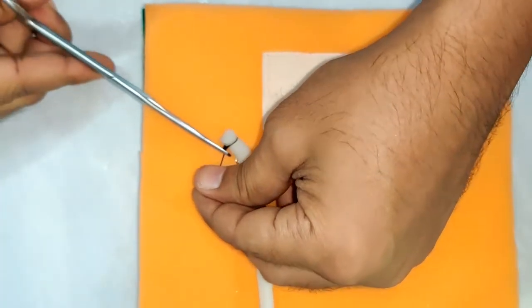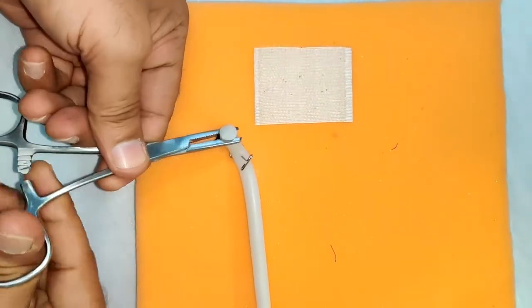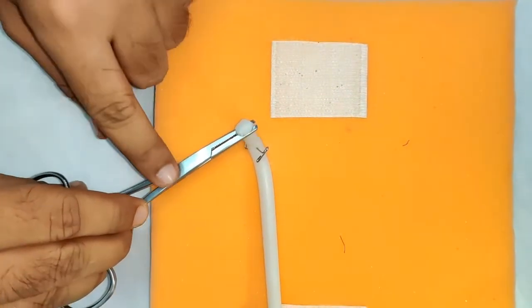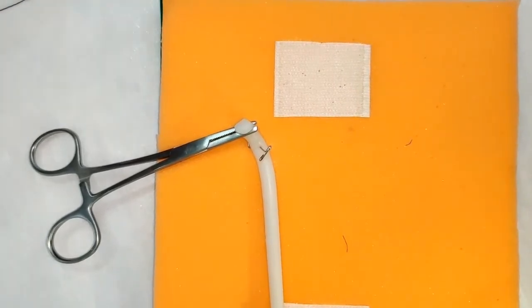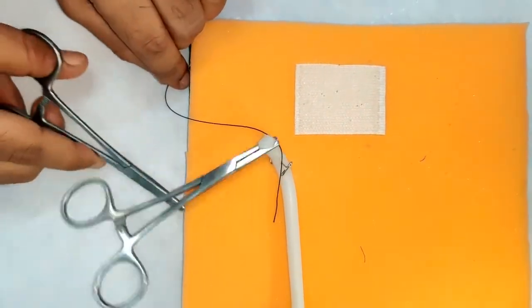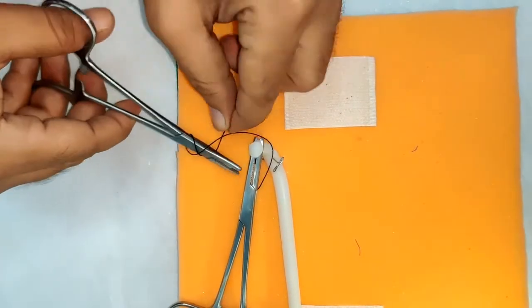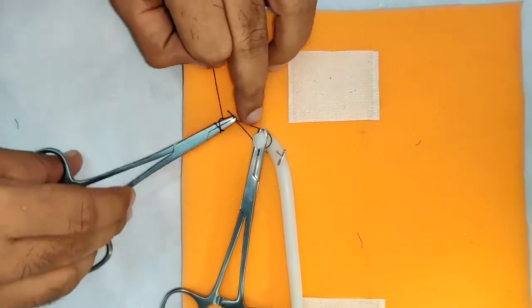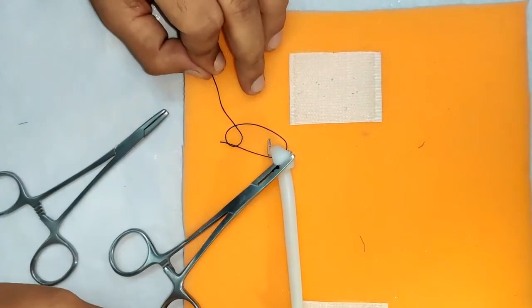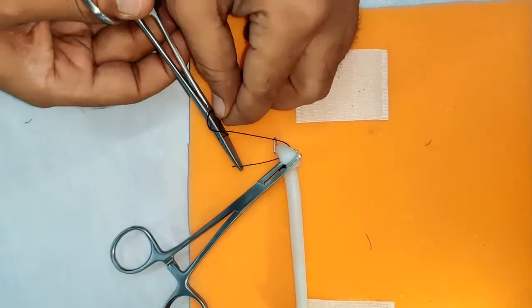In many instances you have a bleeder caught with an artery forceps, and now we need to tie it. We do this by taking a thread, looping it around it, and passing it around the instrument. You can just do a simple instrument tie — make sure you are going below the vessel — and again do a simple tie.